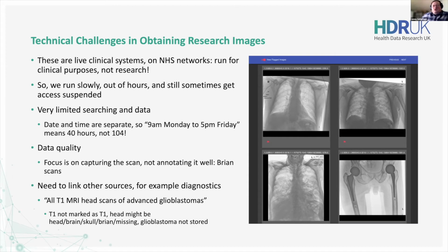But when we do have access and are able to use it, there are some very strange oddities in the search protocol. For example, if you specify a date and time window, 9 a.m. Monday and 5 p.m. Friday, in the DICOM standards that can be interpreted as a total of 40 hours, 9 to 5, Monday to Friday, as a working week, rather than the way you might view it in a normal database search.